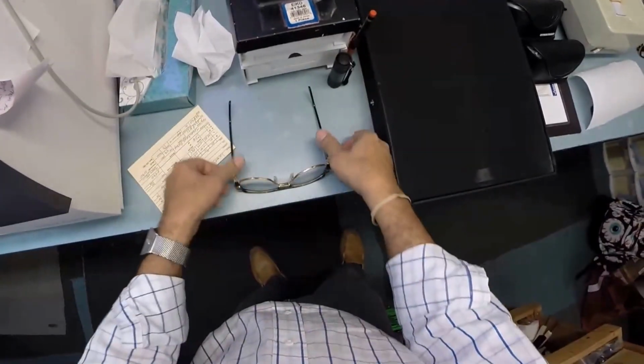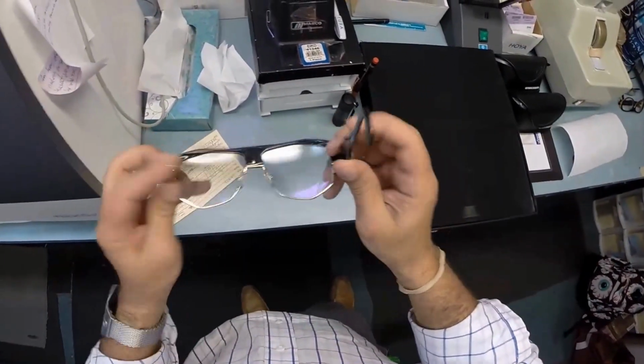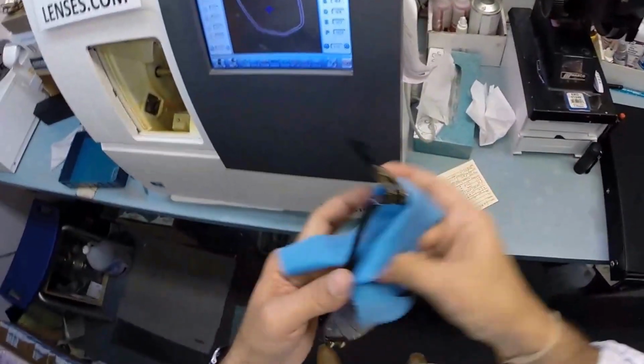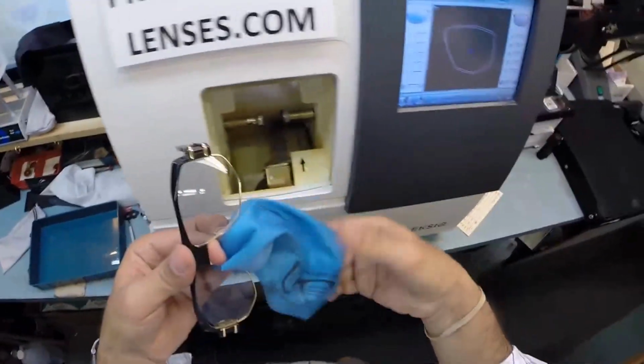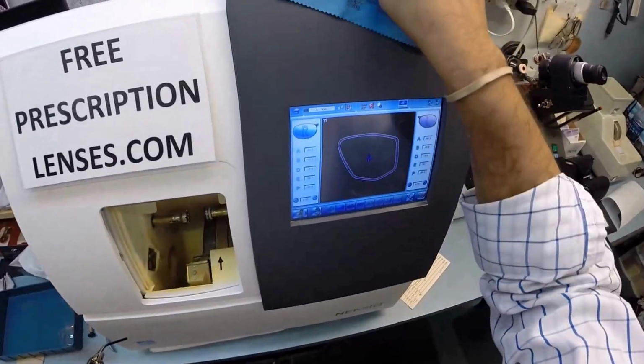So let's flip this over, press down, no wobble, close each temple to make sure they overlap perfectly, and they do, and neither of their temples is askew like that. So this is what, actually, hang on, let me clean this a little better before I activate the transition. This is what your lenses look like now while they're clear before they're activated. Of course, I'm going to provide you one of my premium microfiber cleaning cloths from my website.